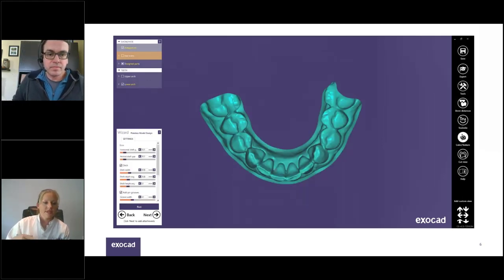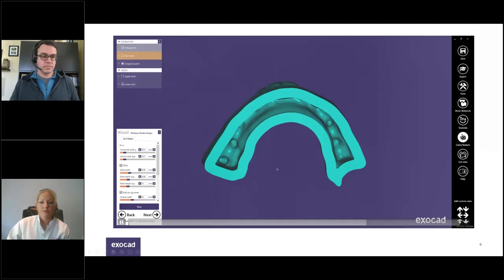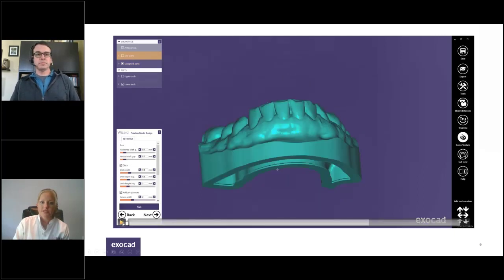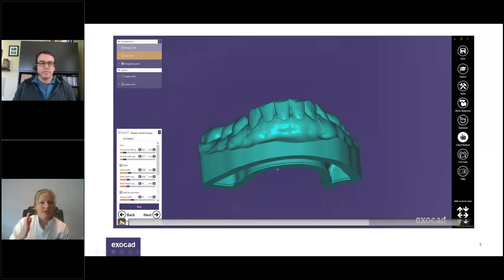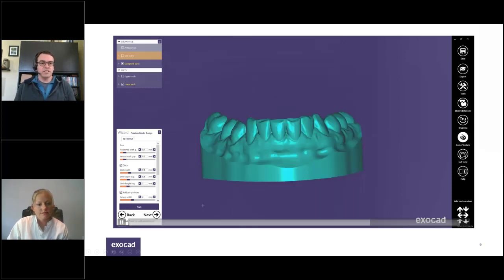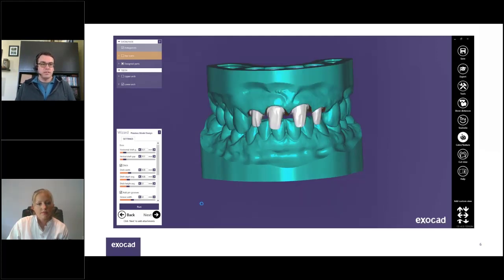One thing too is a lot of times in the clinic you really won't need removable dies, so there is an option where you can just not have them removable if you're just checking the contacts before you're going to seat the crowns, or maybe the contours of your design. Yeah, good point. We could not have the dies sectioned out. So we'll go to the next step here.